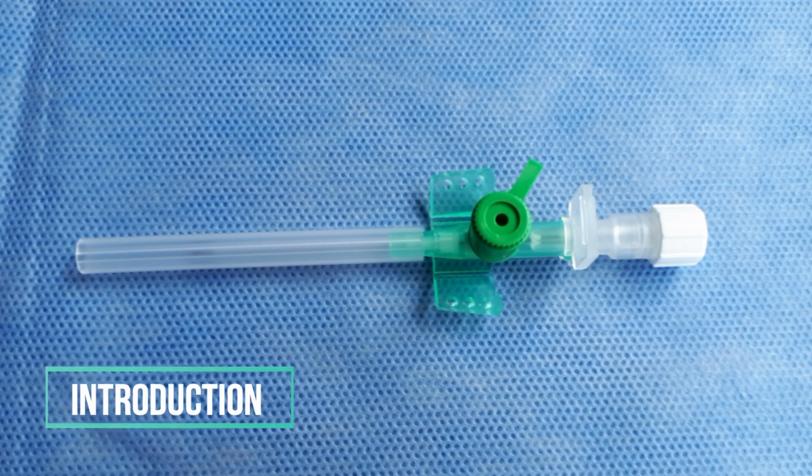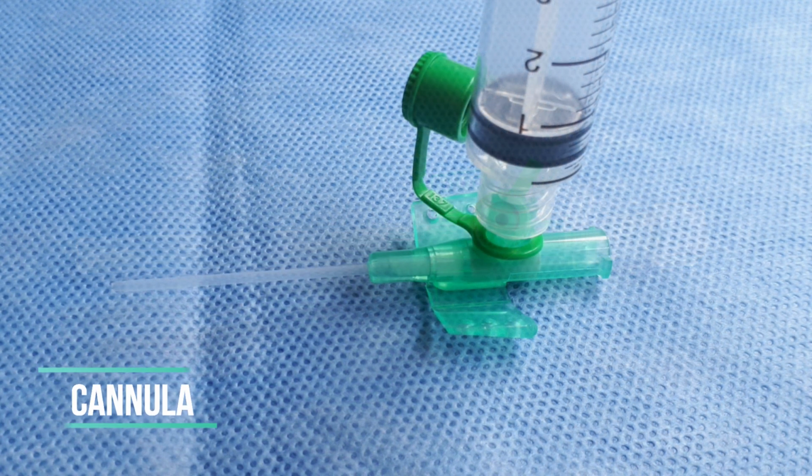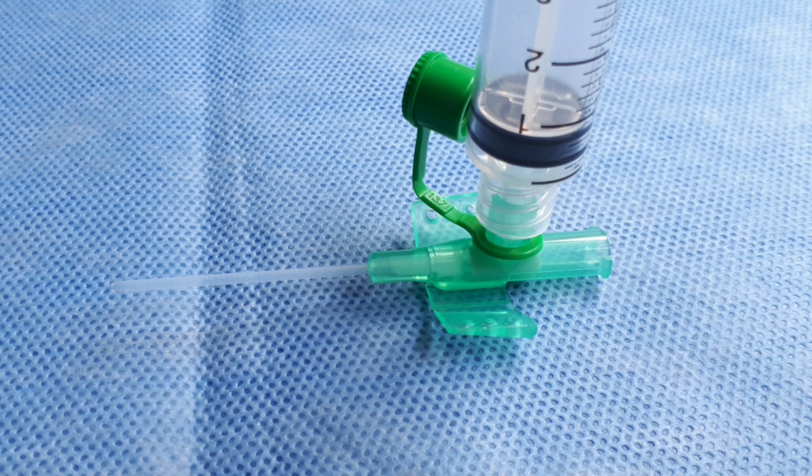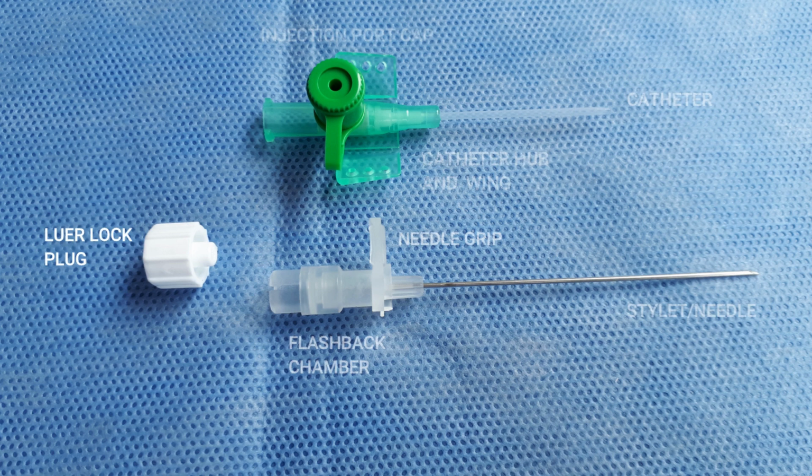Intravenous cannulation is a technique in which a cannula is placed inside a vein to provide venous access for the sampling of blood, as well as the administration of fluids and other things. A cannula is a tube that can be inserted into the body, often for the delivery or removal of fluid. A cannula is composed of the following parts: an injection port with the cap, a catheter hub and the wing, a catheter, a luer lock plug, a stylet, a flashback chamber, and a needle grip.